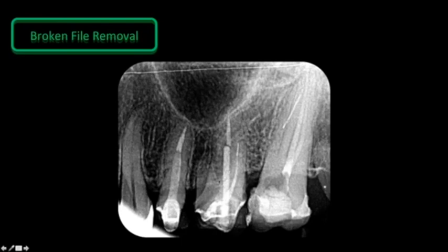In this case, the female patient presented to the clinic with a history of treatment with a broken file in the mesial root of the second maxillary left molar. She claims the previous colleague broke the file while treating the tooth, and she feels the instrument while she is running. The broken file is in the mesiobuccal canal. After cleaning all the canals, I tried to remove the broken file.